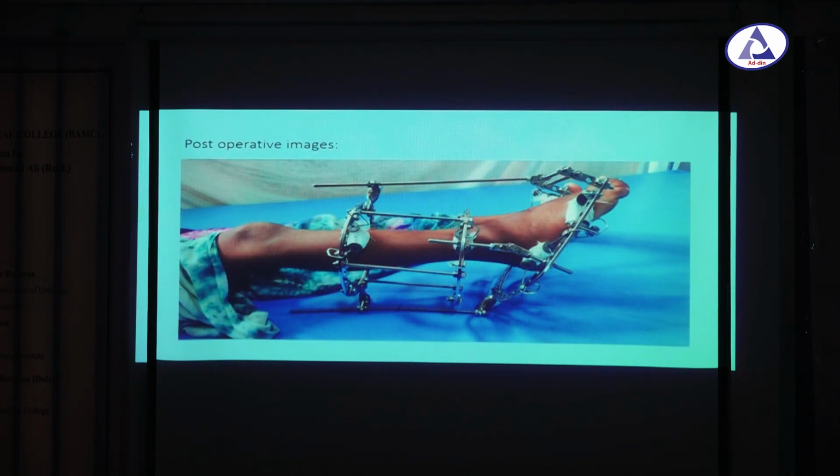And this is the post-operative image after application of Ilizarov external fixator. Actually, this image looks very crowded, a lot of apparatus around the foot, but inside the bone there are very few things. One ring is in the middle of the leg, another ring is just 2 to 3 centimeters above the ankle joint.